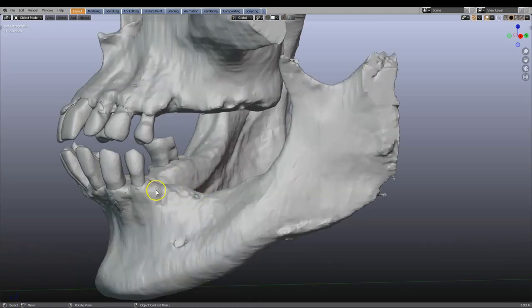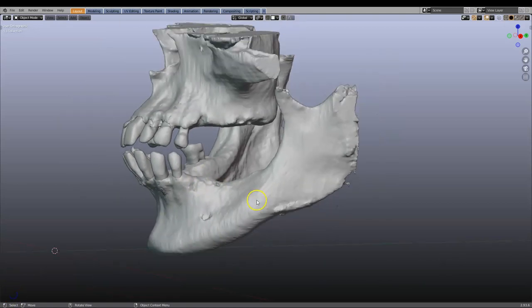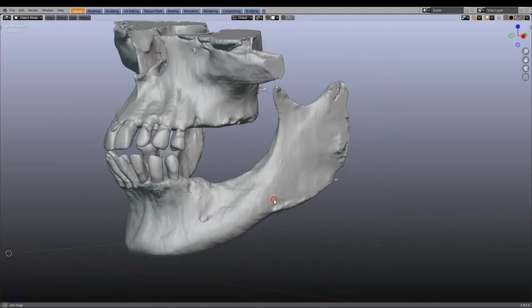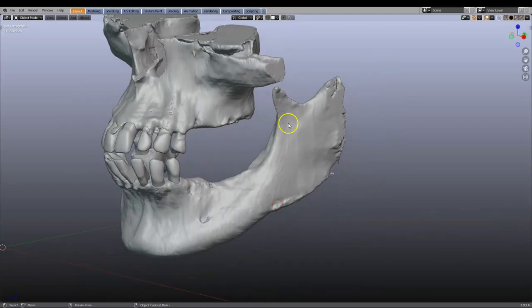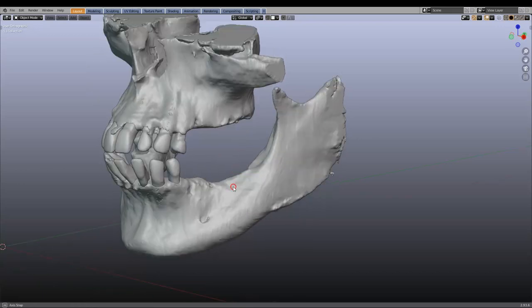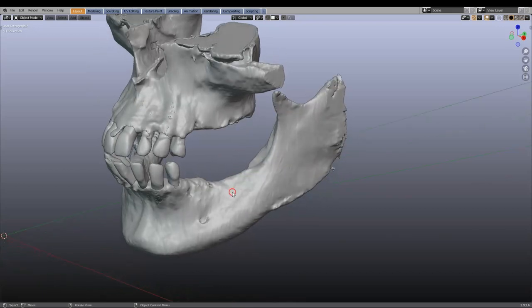In this video I'm going to make a quick subperiosteal implant. This is not a patient case and there is sufficient bone not to do this, but this is an example only.